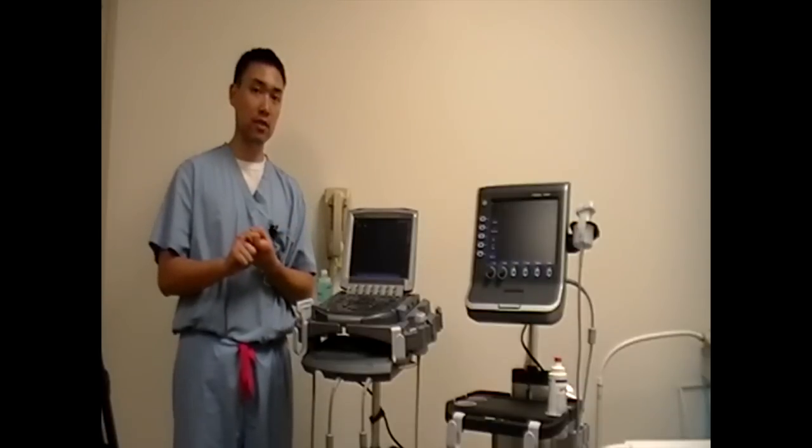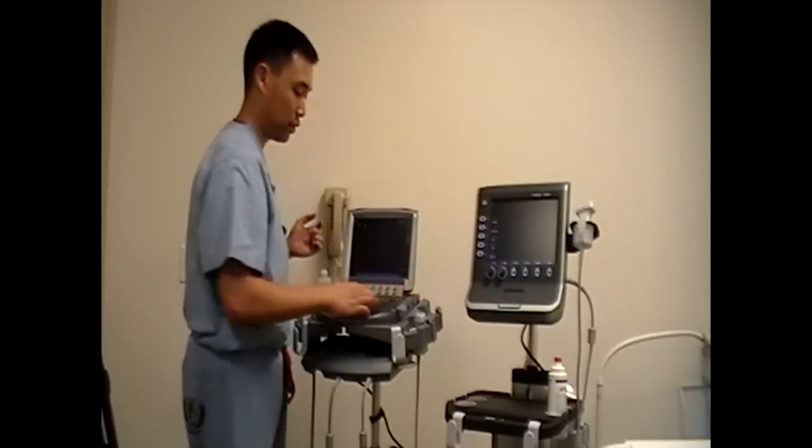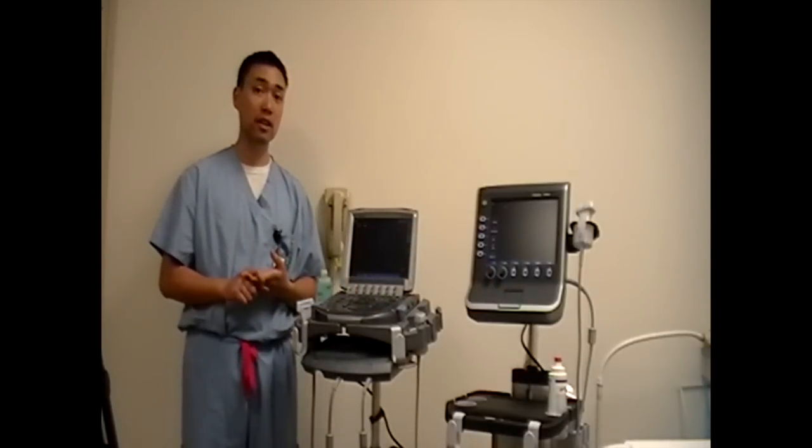One thing is never touch the screen itself. These aren't touch screens — all buttons are on the bottom right here, so don't touch the screen. Also, if you ever have any questions regarding any issues, always feel free to ask an instructor, and they're all trained to use the ultrasound machine.